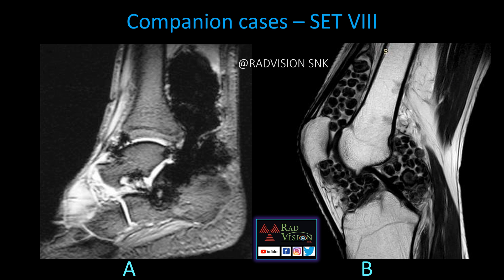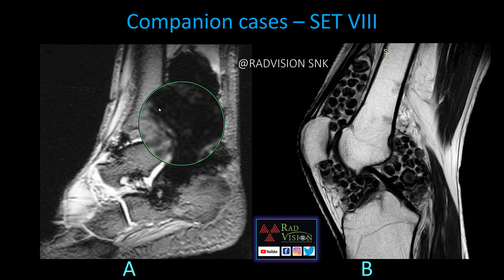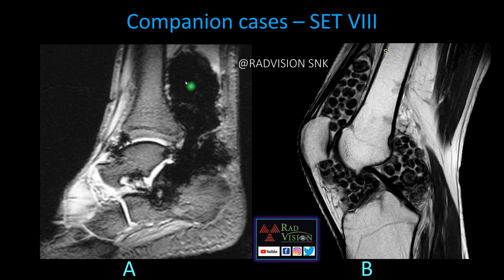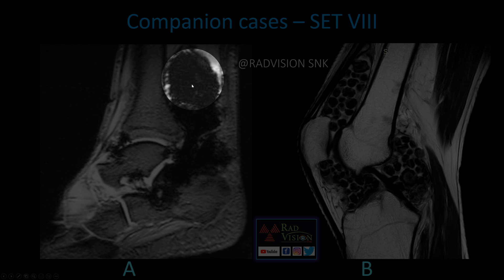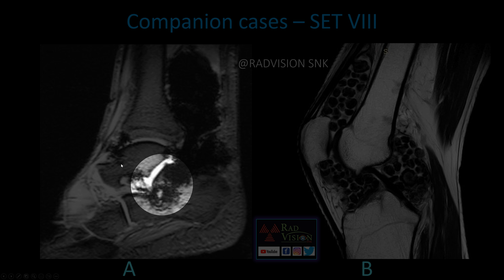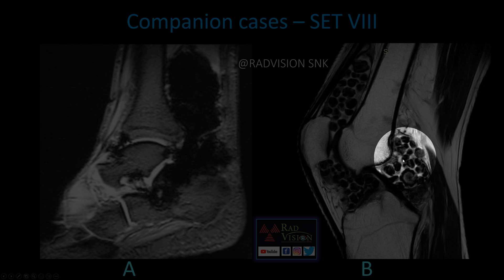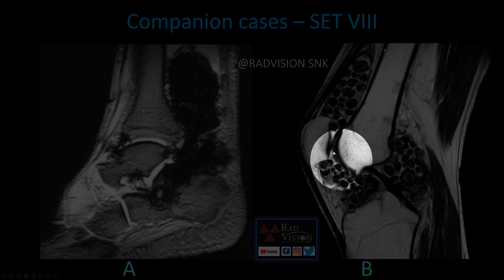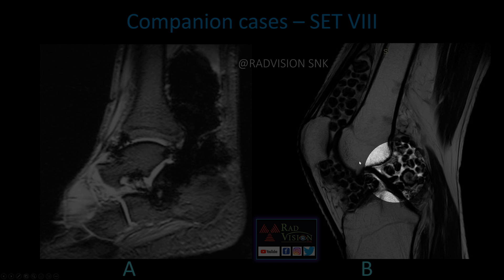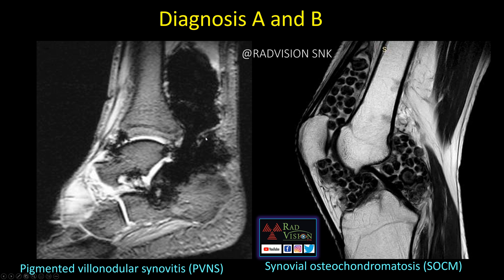Next case shows multiple lobulated synovial thickening adjacent to the ankle joint with significant blooming on GRE sequences — this is pigmented villonodular synovitis. The second case shows multiple round to oval hypointense nodular lesions with blooming on GRE at the knee joint — this is synovial osteochondromatosis.